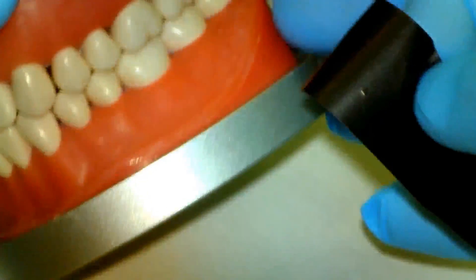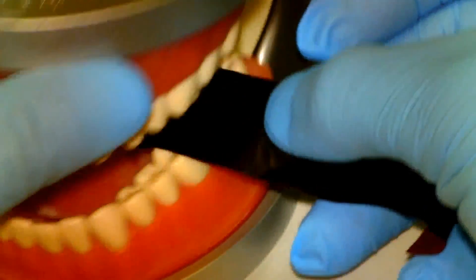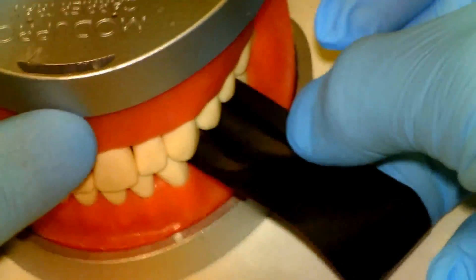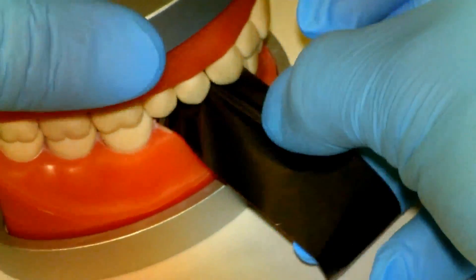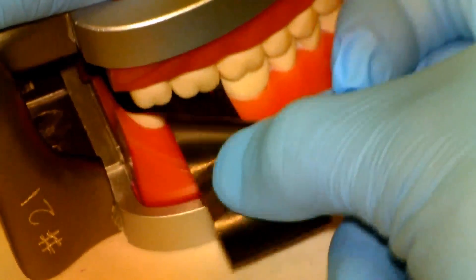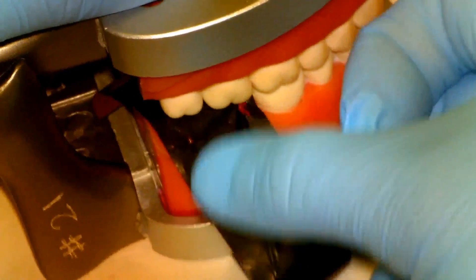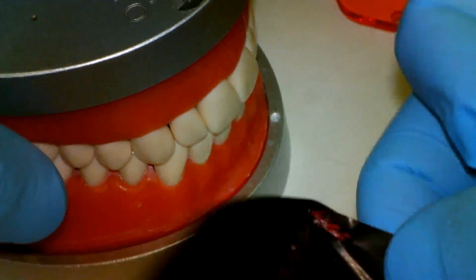We're going to start the calibration process and take our acufilm, which is 21 microns in thickness. We're just going to go around and see where our initial marks are. If teeth are coming together, when you tug on the acufilm you won't be able to pull it through. Whereas if you have an area that isn't in contact, you'll be able to pull it straight through.